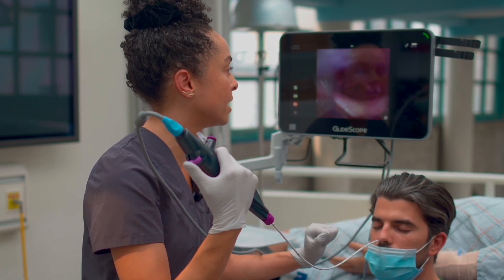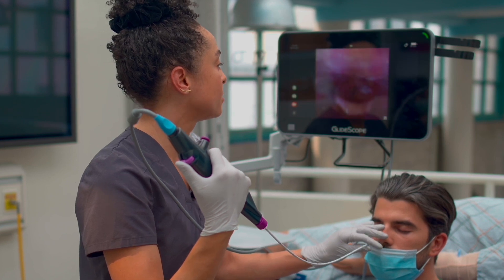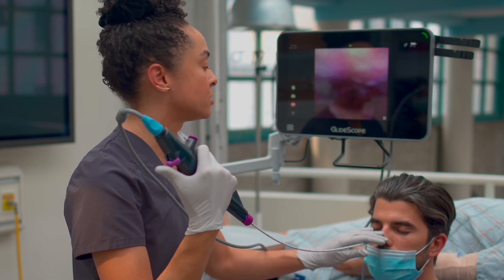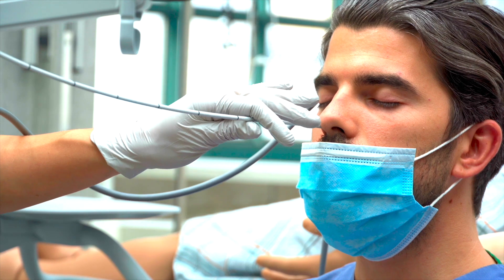Now stick out your chin like you're sniffing a flower — a little bit more, good. This is the sniffing position, and this opens up the larynx. You can see the vocal cords really nicely, you can see the airway — that black V there. I'm not going to go any further. I'm going to come out, making sure first that the lever is in the neutral position so the scope is straight, and then just come out slowly.